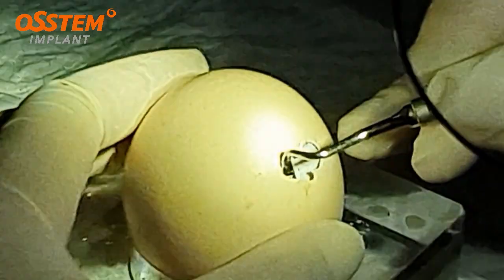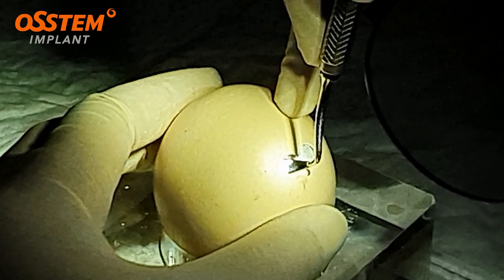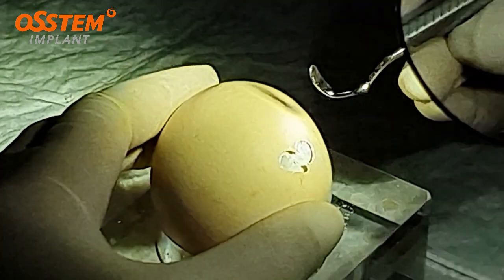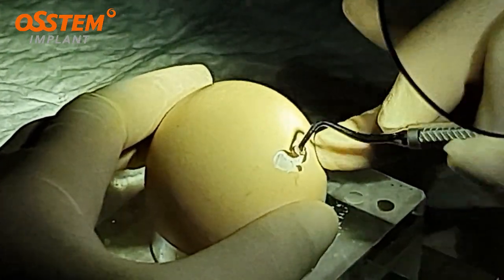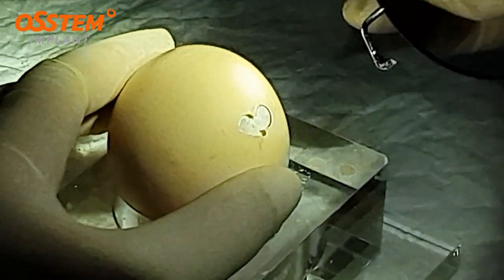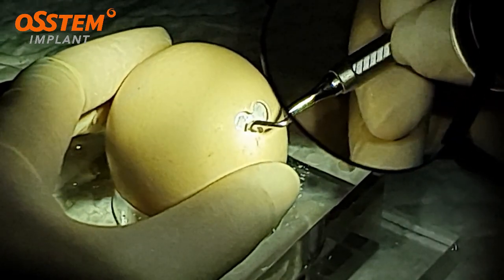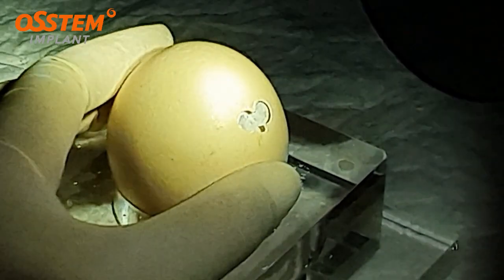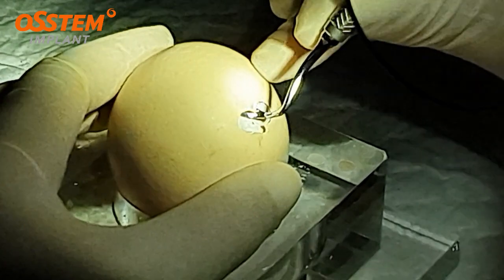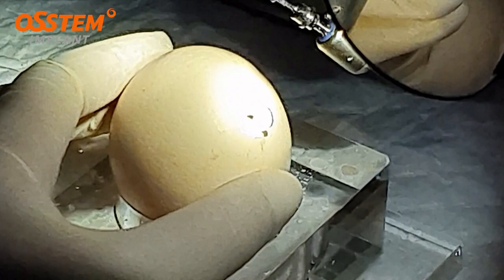I'm going to now use the sinus instrument to separate the membrane. So carefully, gently, I'm going to push the membrane — on the mesial part, the medial part, the floor of the sinus, and the distal wall. Let's make a clean shape of it.